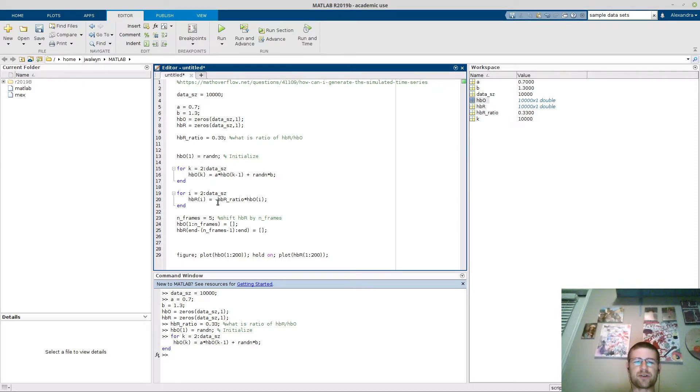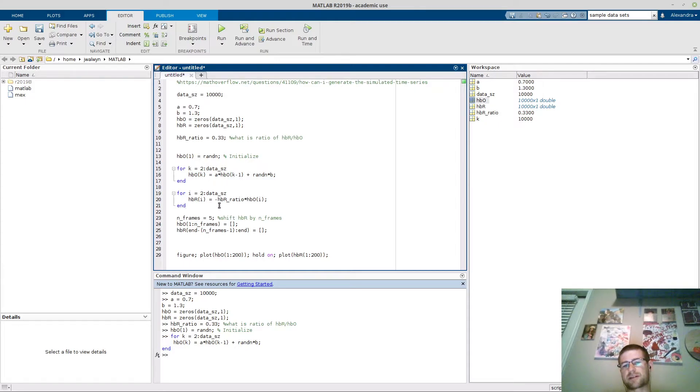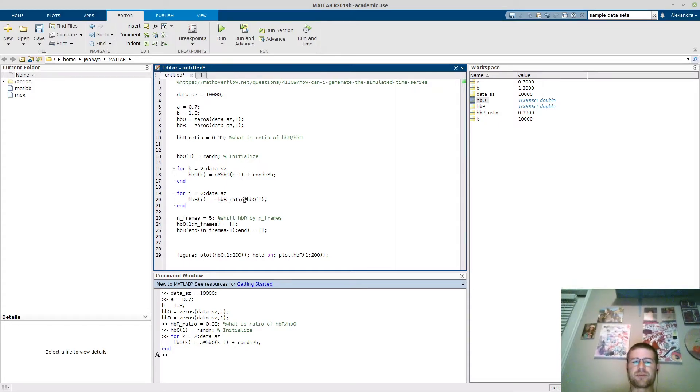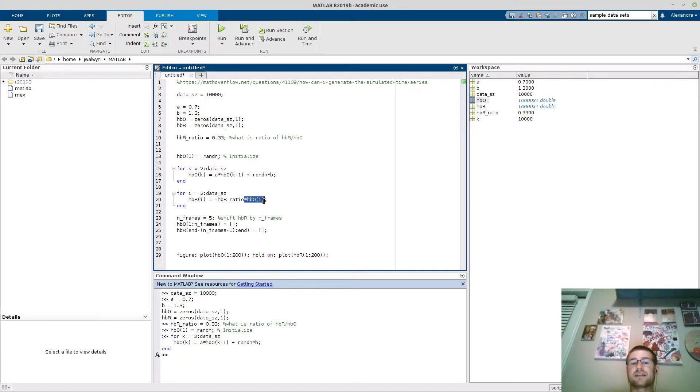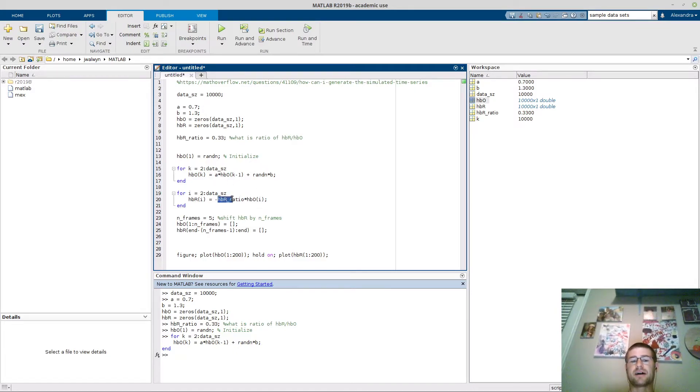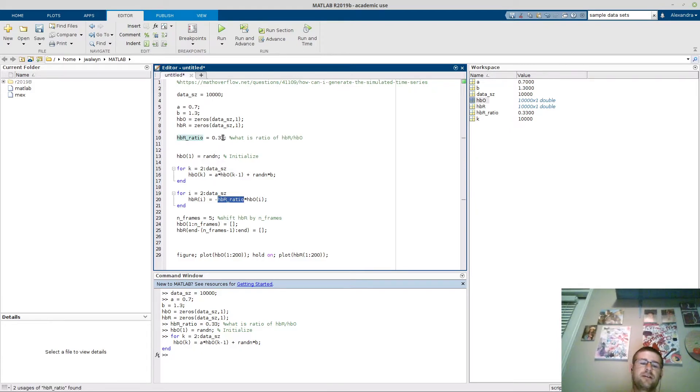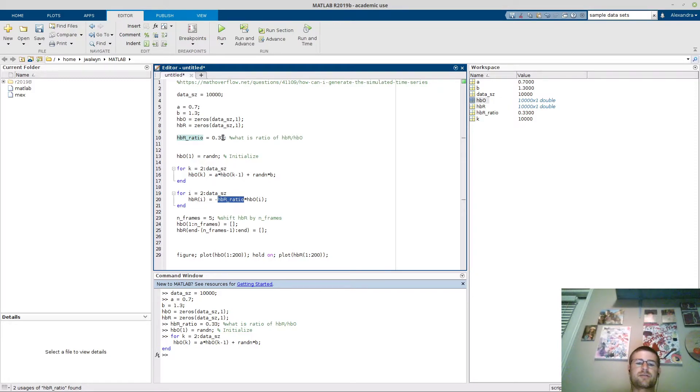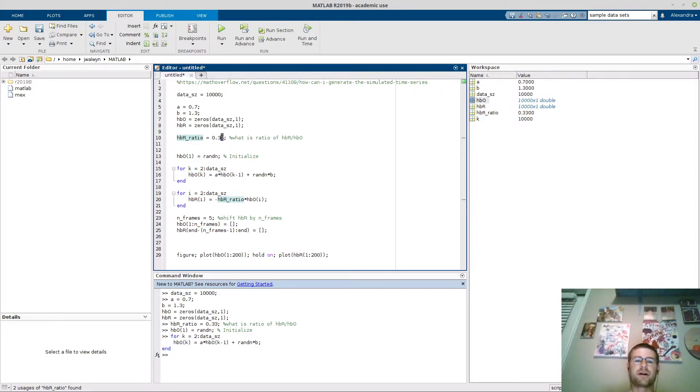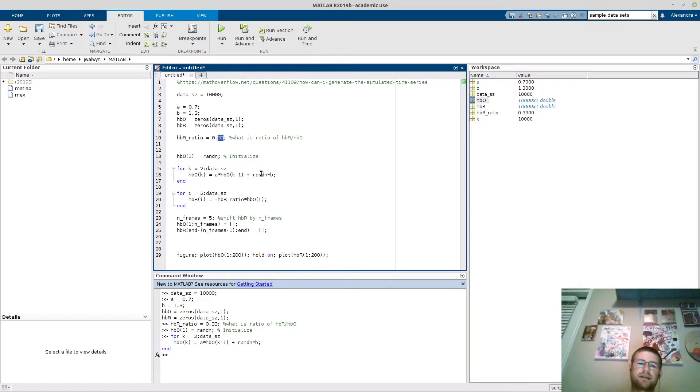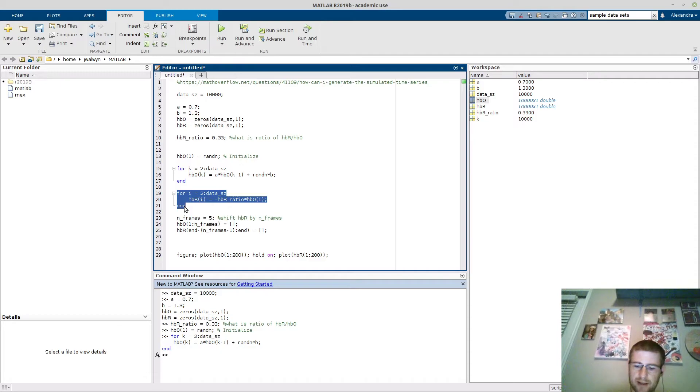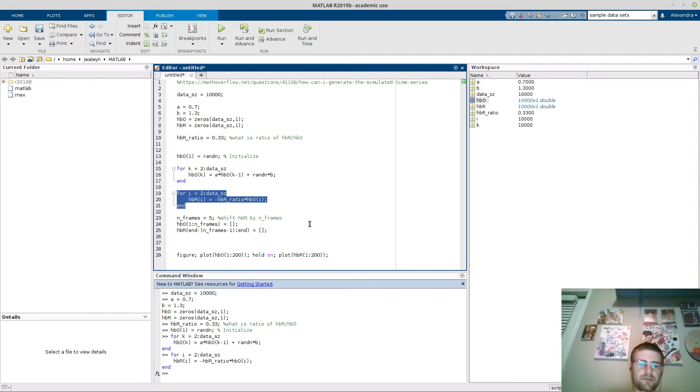What I am doing here is I'm going to multiply it by a negative. The negative denotes that when oxy goes up, deoxy would be expected to go down and vice versa. I'm going to multiply it by the value that's currently in HBO and by the HBR ratio. So basically what I'm going to do is say, okay, for every value of oxyhemoglobin I'm going to multiply it by one-third and I'm going to invert it. So I'm going to decrease the amplitude and flip it. Go ahead and run that and press F9.